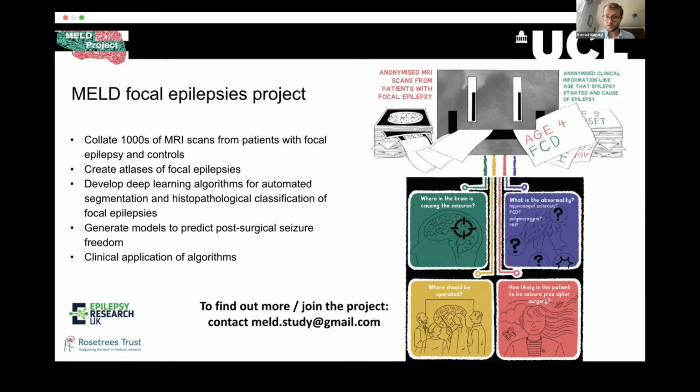And another feature that we're trying to change now is that we would like to also get the post-operative scans to say, does resecting what we identify give you a good outcome? So was the abnormality resected, and did the patient have a good post-surgical seizure freedom?